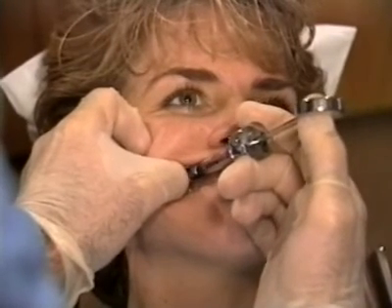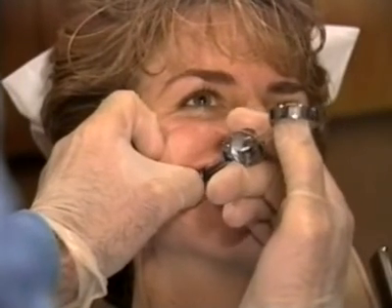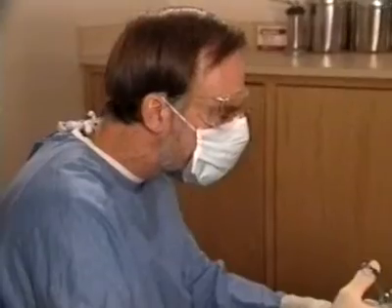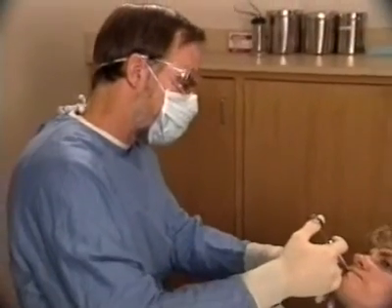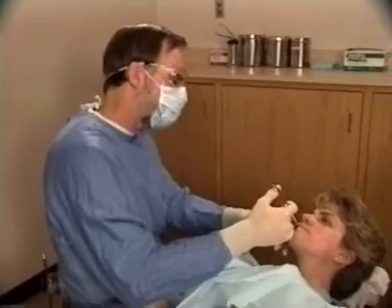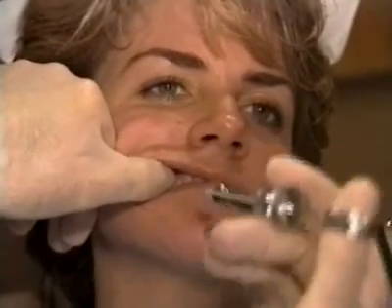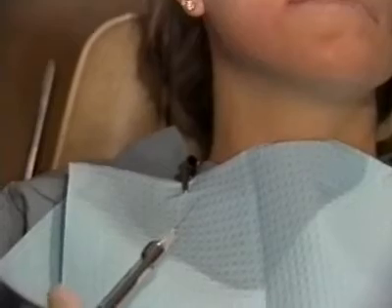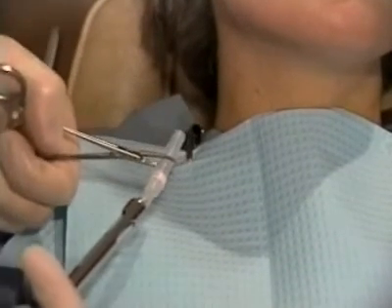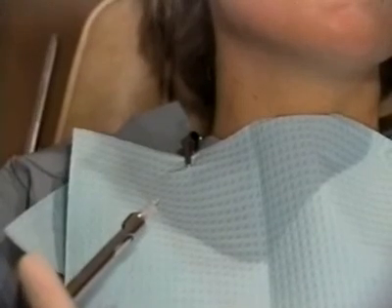In response, the patient may move to avoid the stimulation or the clinician may adjust the syringe to improve patient comfort. In either case, lateral rotation of the syringe automatically forces the needle medially. A possible answer to this problem is to bend the needle approximately 15 degrees at the hub. Then the syringe can be kept off the mucosa as the needle is advanced posteriorly.